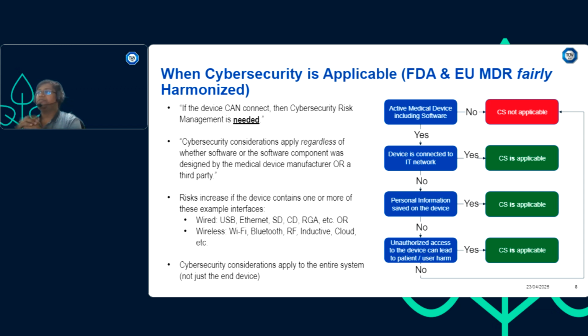And the last very important point we need to mention here and keep in mind is that we need to test the complete ecosystem, not only a partial part of it. Why am I saying this? Due to the nature of our business, we get to see a lot of testing reports, a set of documents with us.